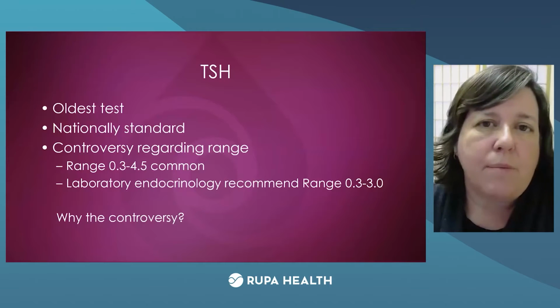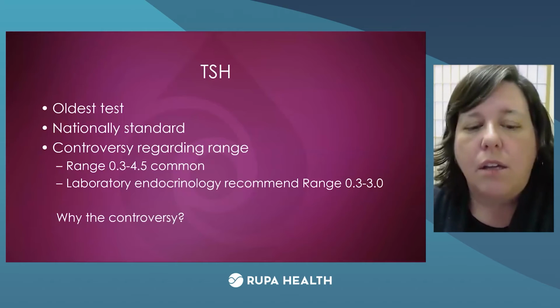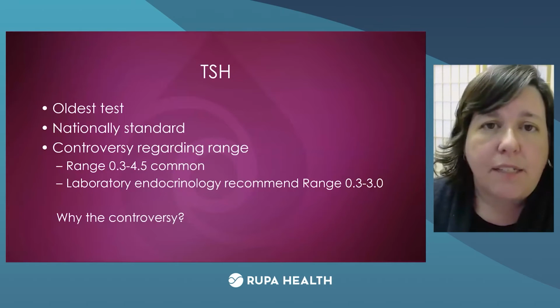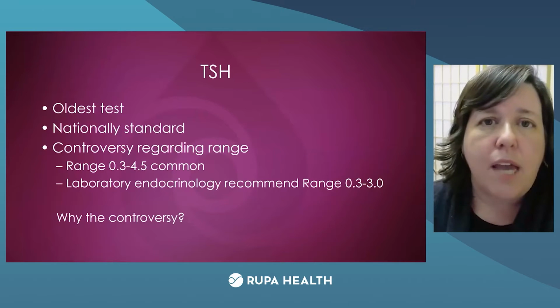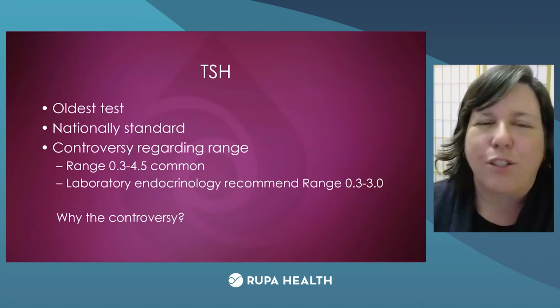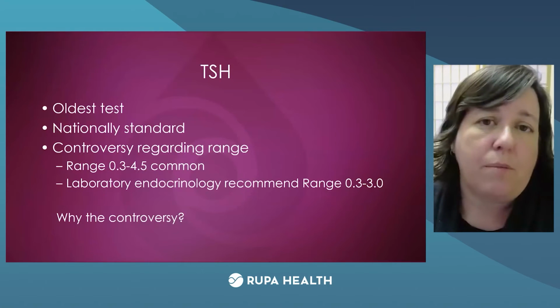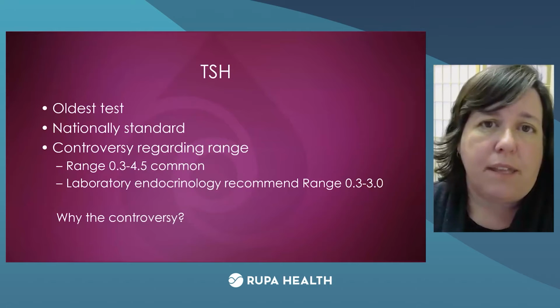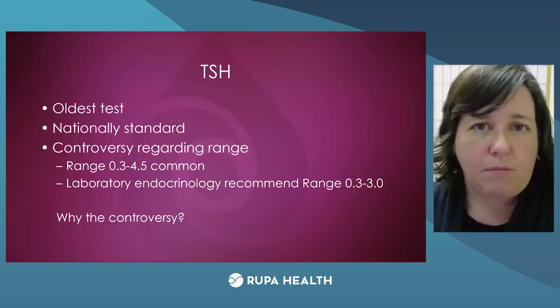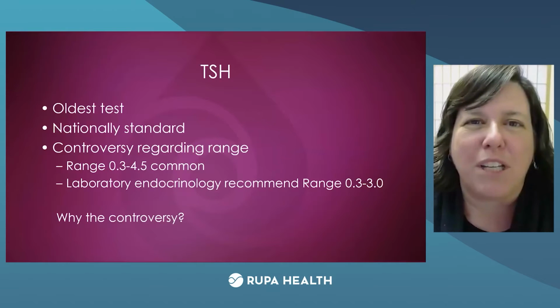So one thing that always comes up is blood spot. How accurate is blood spot versus a serum draw? We do blood spots for TSHs all the time. Every baby that's born does an infant PKU test. Part of that PKU panel is a whole bunch of other things, including thyroid markers. So TSH markers for babies have been developed since the early 50s. We're just taking it from babies land into big babies who don't like blood draws, or people who live rurally, or all the other ways that you might want to use a thyroid test.